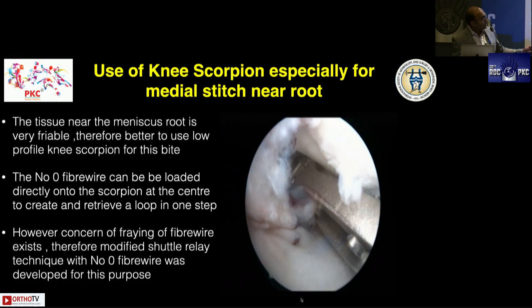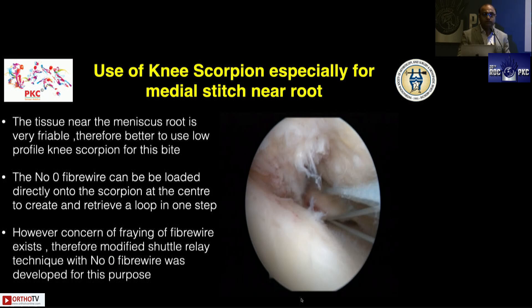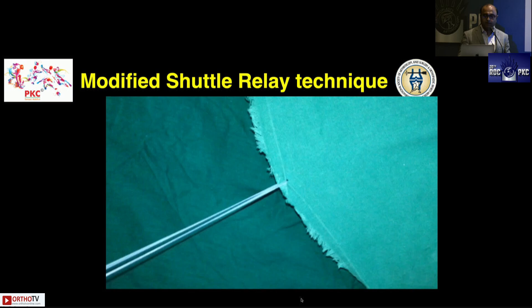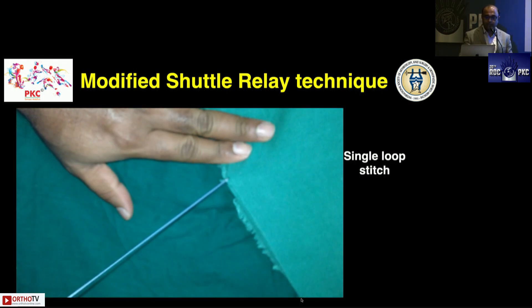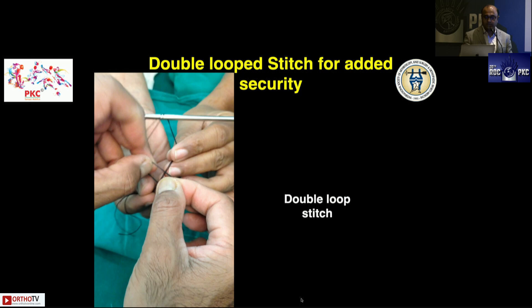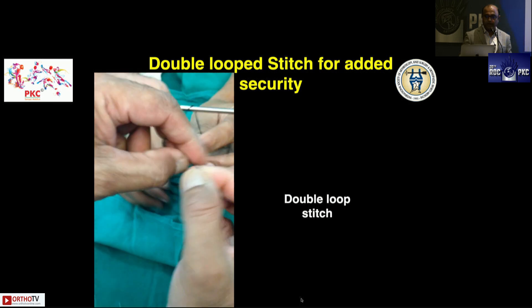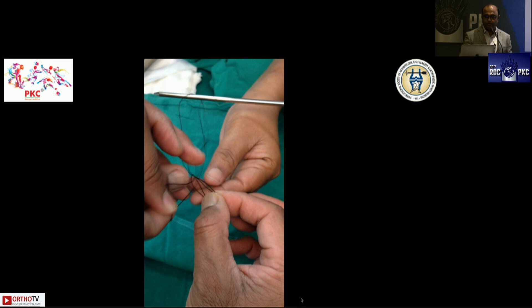This is a presentation from PKC 2016 — the early days of the knee scorpion when we were not aware of how to take the bite. I had taken it near the root area, which is not of good quality, and we were not yet using tapes. Now we have mini tapes and know it should be a locked looped construct. In those days we used ethylon two-zero on the knee scorpion, shuttling a fiber wire and using either simple locking sutures — a single loop stitch — or a double loop stitch to increase security. You create a double loop and load the sutures onto that double loop for double security with a fiber wire.